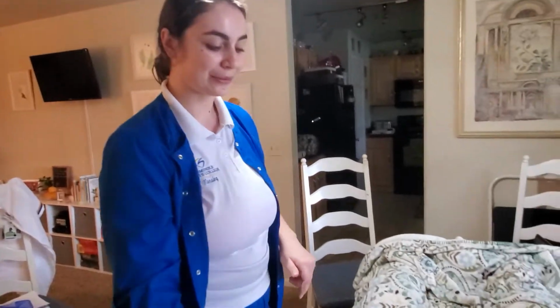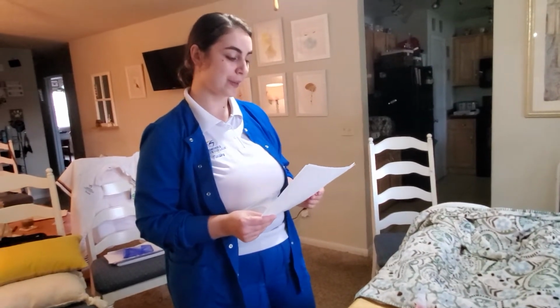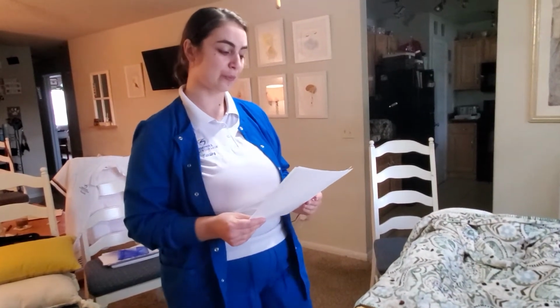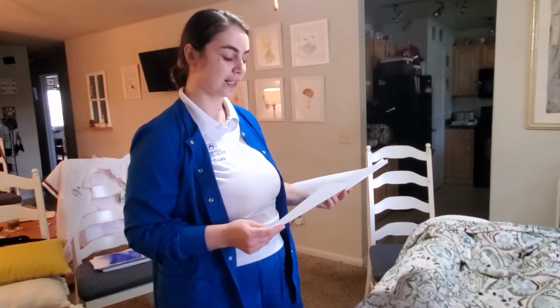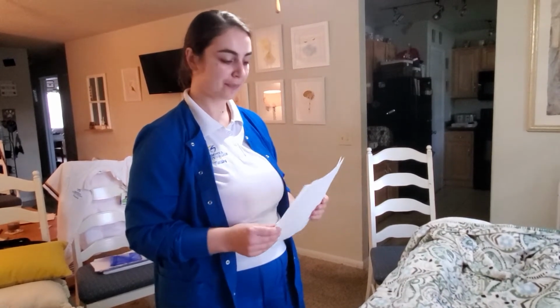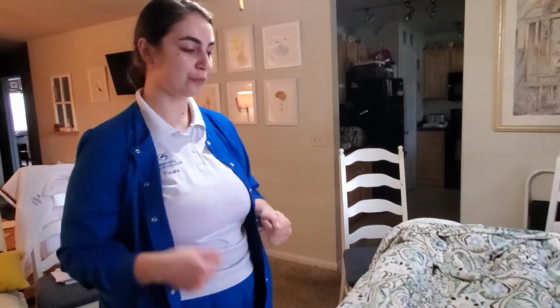Okay, so the first thing we're going to be doing is I'm going to verify the orders to the patient and the patient's allergies to the patient and to the orders. So I have my orders here, and I see that Anna Pawlowski, who has an allergy to penicillin, who was born 5/5/57, has orders for an indwelling catheter insertion. So now that I see that, I can go into the room and begin.